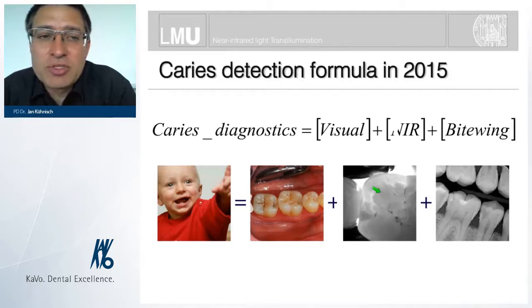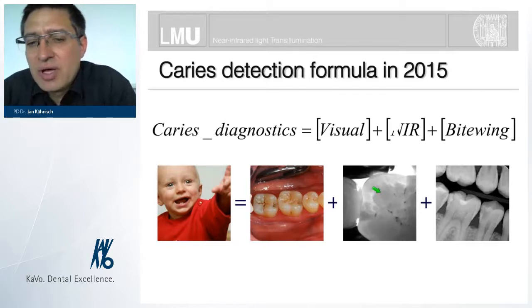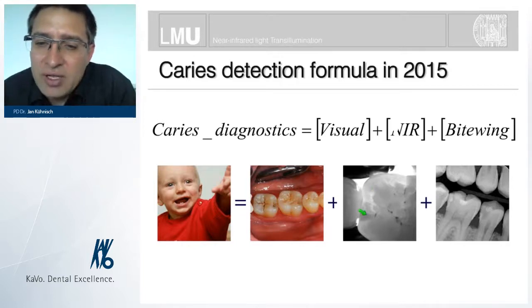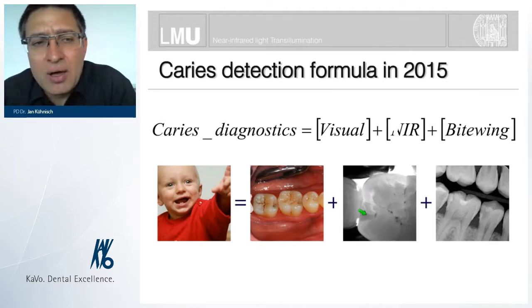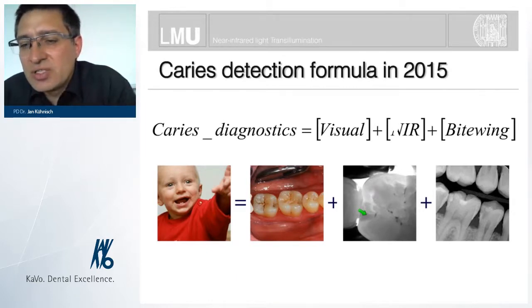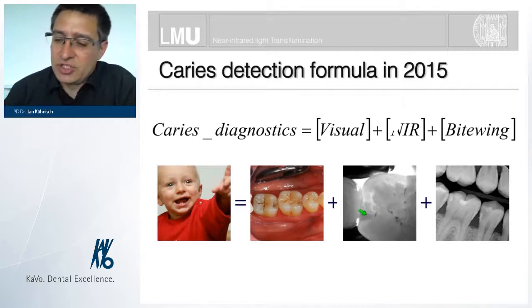Maybe this is my special perspective as a pediatric dentist, that I have the opportunity to screen the teeth much better in comparison to a bite-wing radiograph, which is less frequently accepted by young patients. And furthermore, if I'm seeing lesions like that, then I prescribe a bite-wing radiograph, and it means then I have the staging of the caries process, and then we are seeing the depth, the grade of progression for these caries lesions.